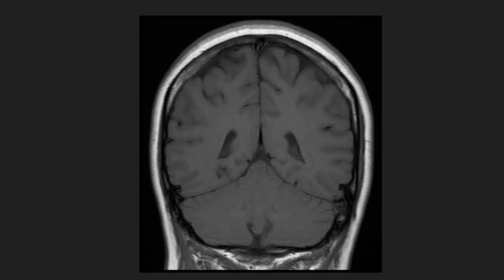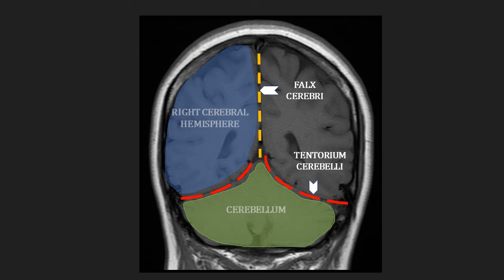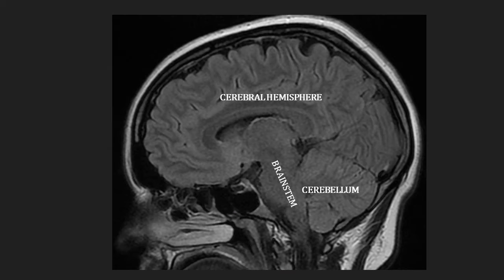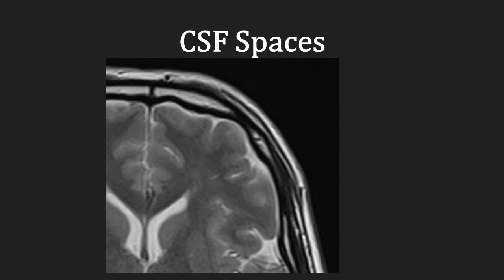Again, in the coronal plane, the orange dashed line represents the falx cerebri, separating the right cerebral hemisphere from the left. The red dashed line represents the tentorium cerebelli, separating the cerebral hemispheres from the cerebellum, highlighted here in green. In the sagittal plane, the falx cerebri is not seen, but you can still see the cerebral hemisphere in blue, the brain stem in purple, and the cerebellum in green. The brain is surrounded by CSF in the sulci, fissures, basal cisterns, and centrally within the ventricles.